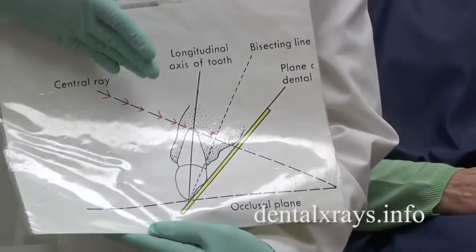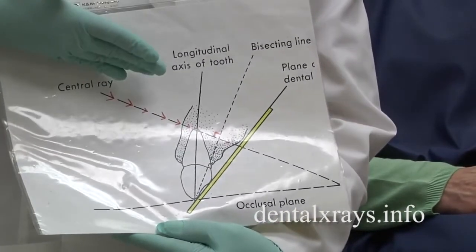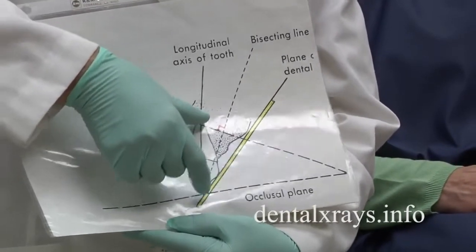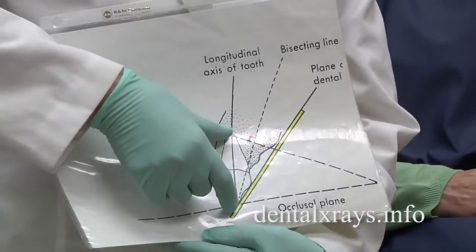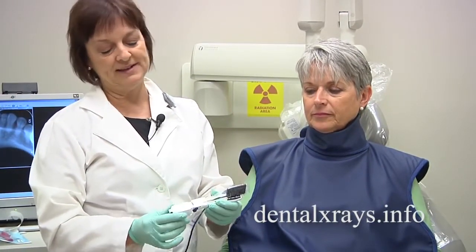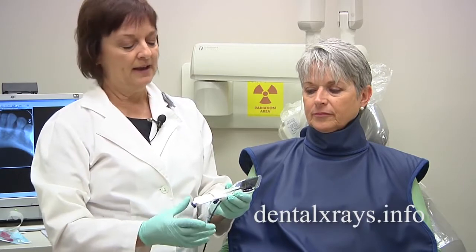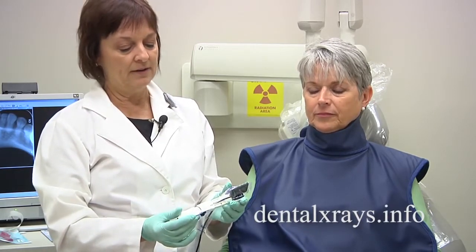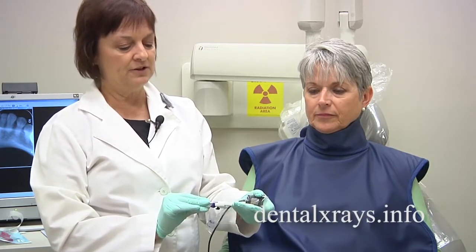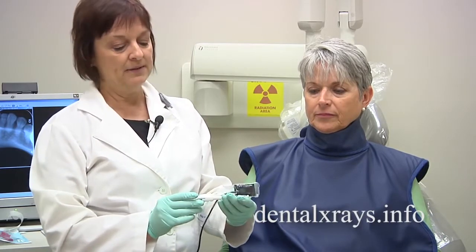So ideally what you need to do is set the vertical tube angle yourself to project the correct length of the tooth. Some offices have sensors only, and I'm going to show you how to use the sensor with bisecting angle. It's pretty much similar to using film or PSP plates, but sometimes you run into a few other problems with it.